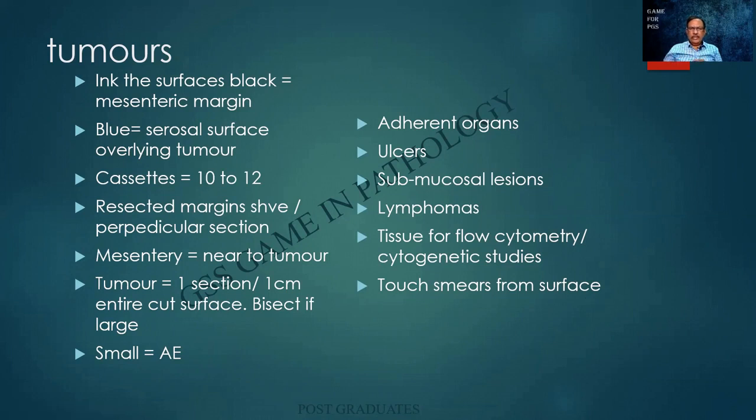This is a beautiful list. Interpretation of biopsy can be a question for you people. And this can be a useful or a very useful parameter for you people.